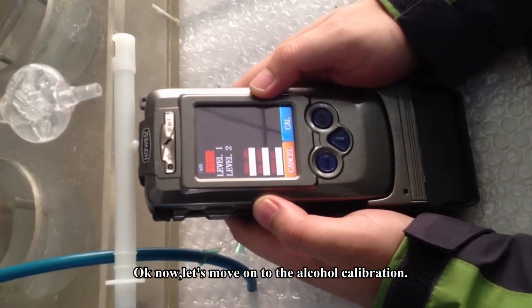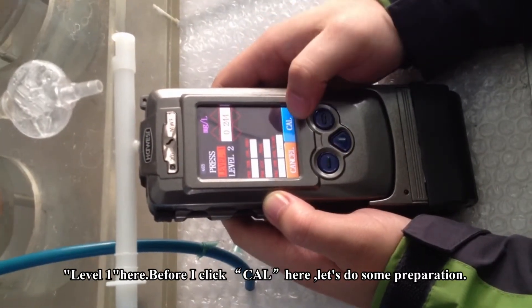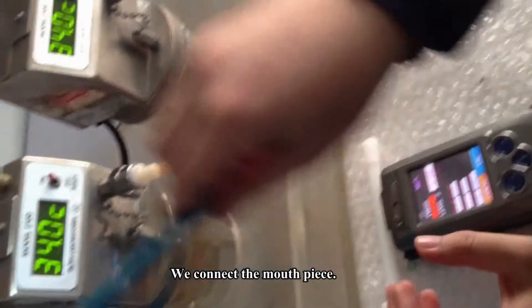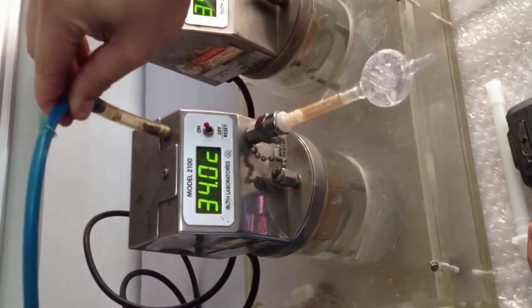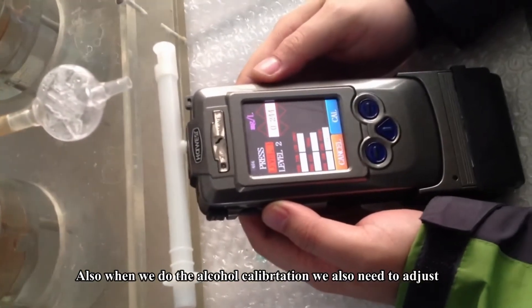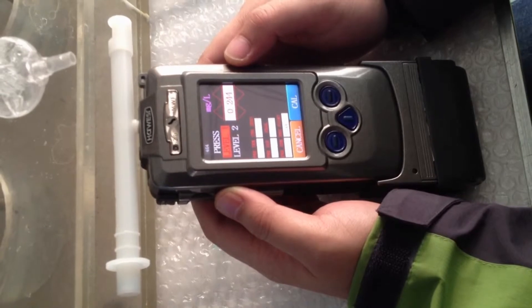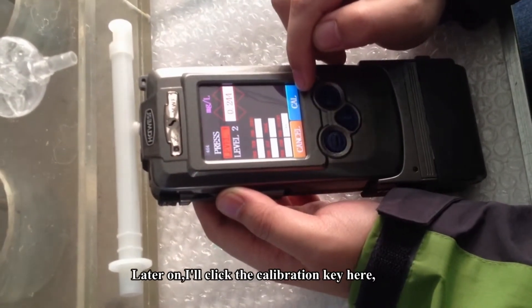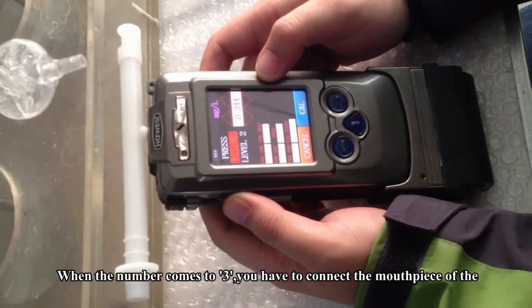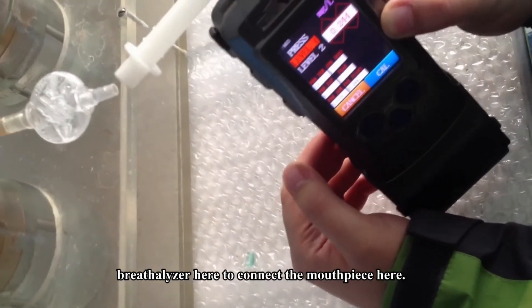Now let's move on to the alcohol calibration — Level 1 here. Before I click the calibration key, let's do some preparation. We connect the mouthpiece. When doing the alcohol calibration, we also need to adjust the flow rate to be 10 liters per minute. I will click the calibration key, and after that there will be a number counting down from 10. When the number comes to 3, you have to connect the mouthpiece with the breathalyzer to blow into it.